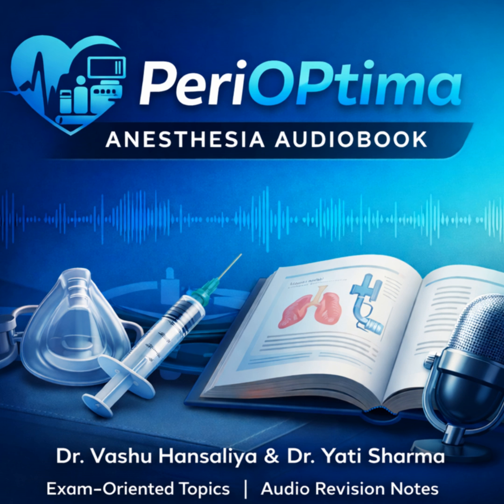Got it. What's indication number 2? Weaning from cardiopulmonary bypass, or CPB. This is the classic anesthesia scenario. You are in the cardiac OT, you've done the grafts, you try to come off the pump, but the heart is stunned. The contractility is poor. Right, the inotropes are maxed out. You insert the IABP to give the heart a crutch to limp across the finish line. It allows the heart to rest for 24 to 48 hours while that stunning resolves.